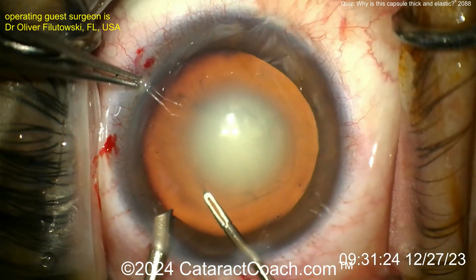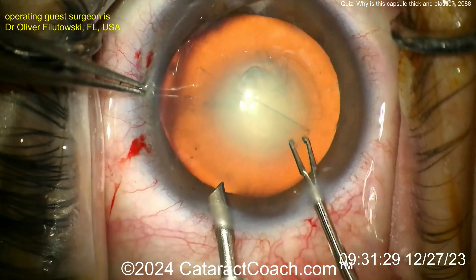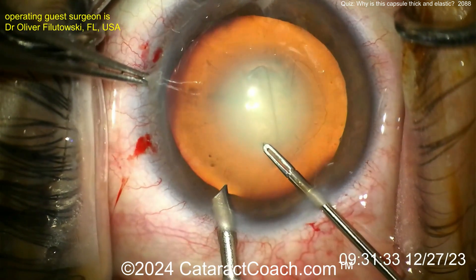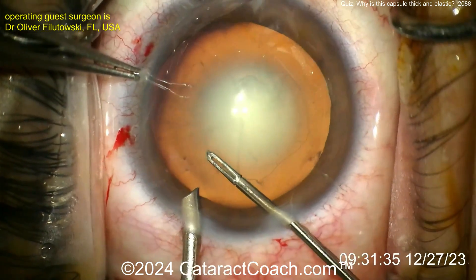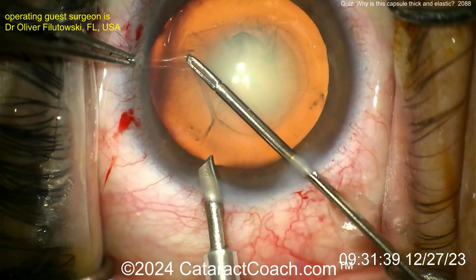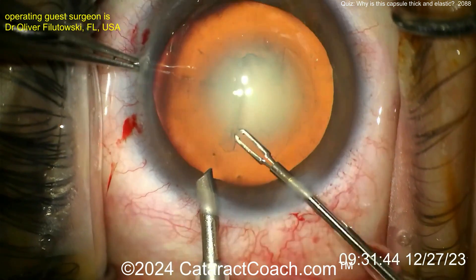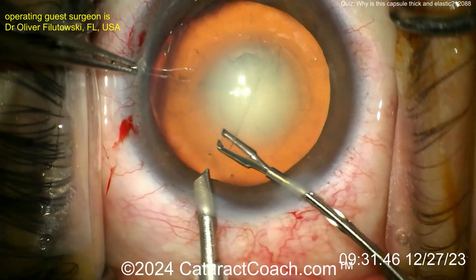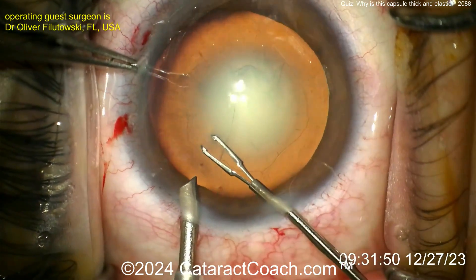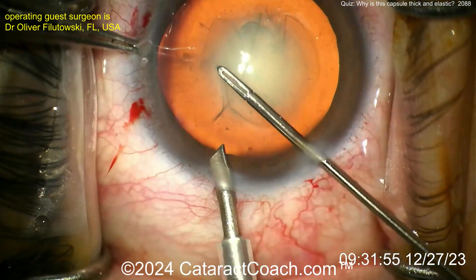Look at how it gives way — it just kind of gets stuck. And again, this is an experienced surgeon who has done a lot of surgery, so it's just an unusual case. I've seen rare patients with a double anterior capsule before, and we've seen the very anterior insertion of zonular fibers — I've had that case on CataractCoach in the last year. We've also seen the more common fibrotic lens capsule. But this is none of those.